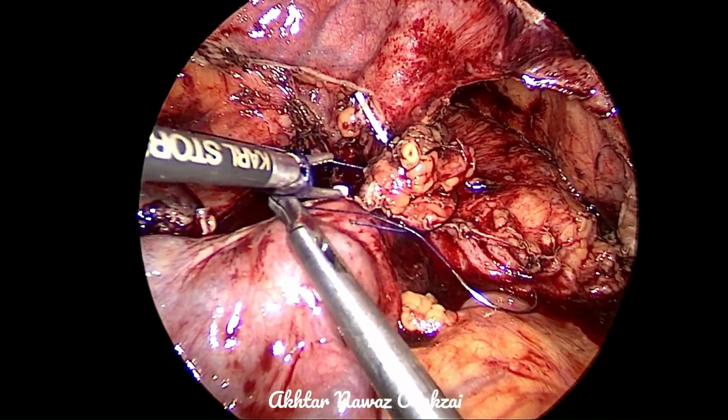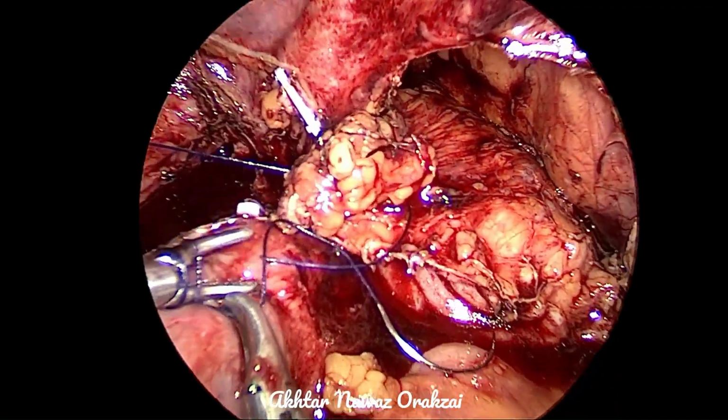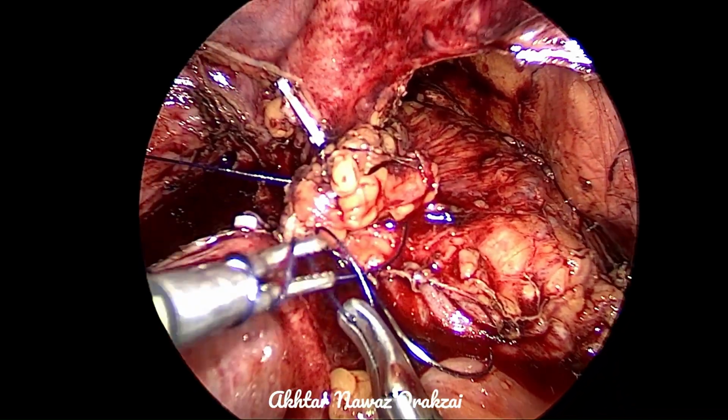Surgeon's knot is applied. This can be done with the Vicryl 2-0.